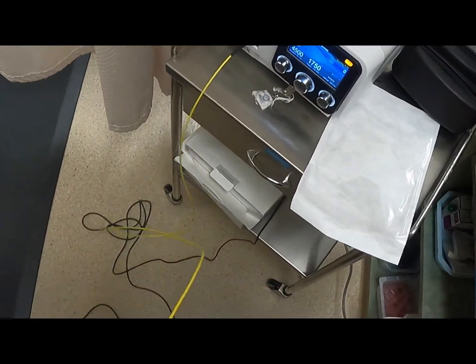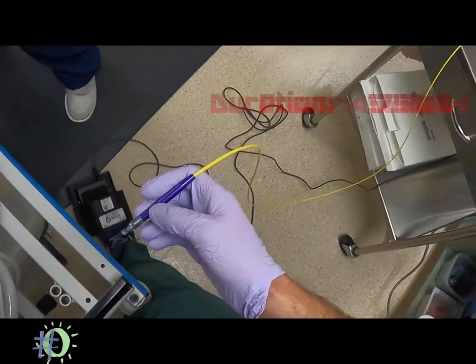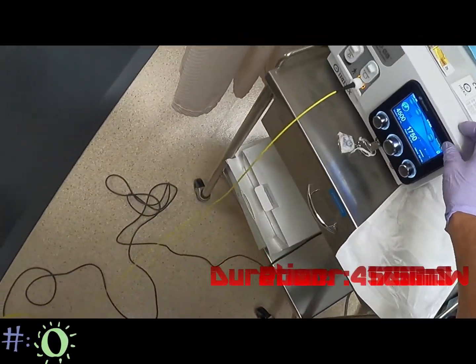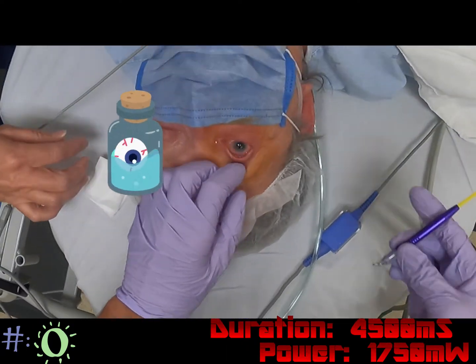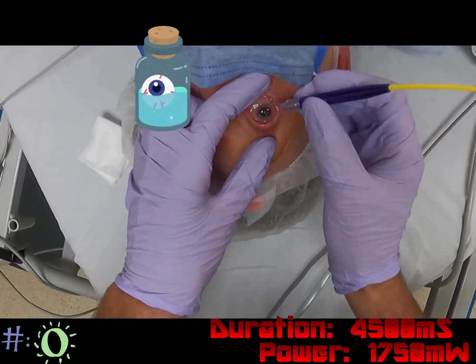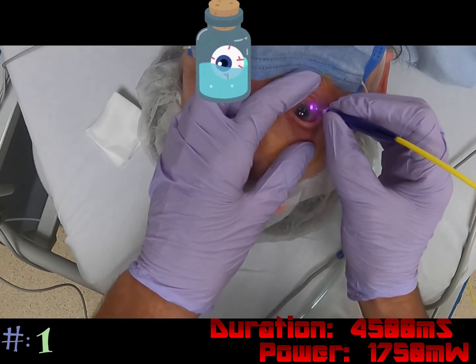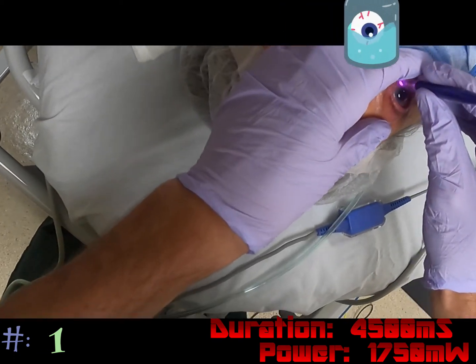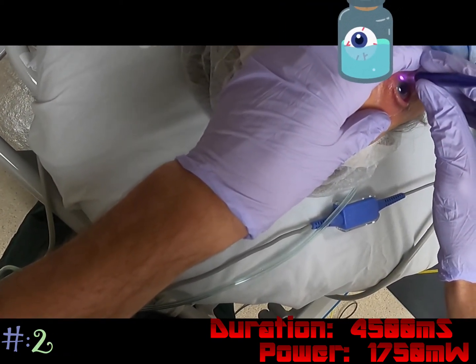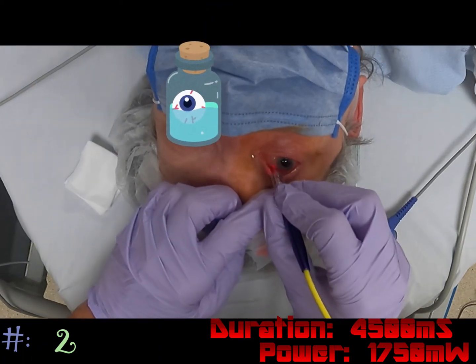Our initial settings are 4500 and 1750, and we're going for 30 spots. We're going to do a test quadrant in each area first. We're listening for snaps, crackles, and pops. I find that the nasal quadrants are usually the ones that are going to crackle first, so I rely on them the most, and superiorly is usually the first for me.